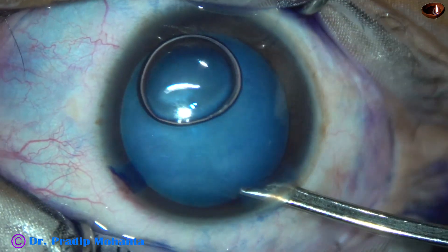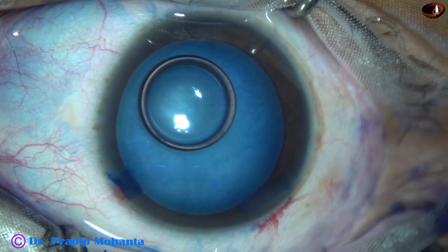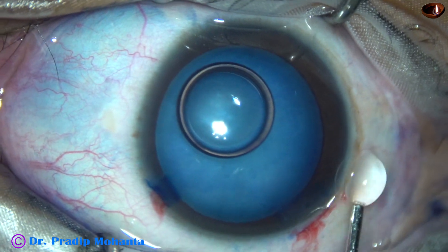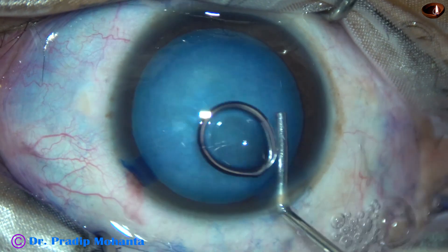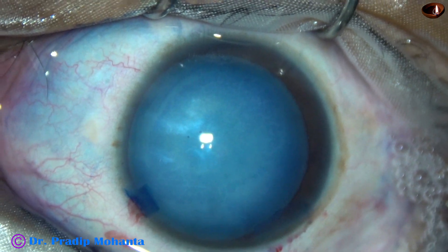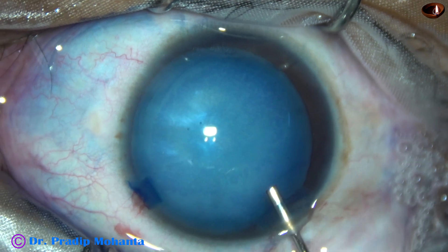Yes. We can see that there is staining of the corneal endothelium by the dye. There is a small air bubble at the center where the staining is less, and around the air bubble there is a lot of staining of the dye.